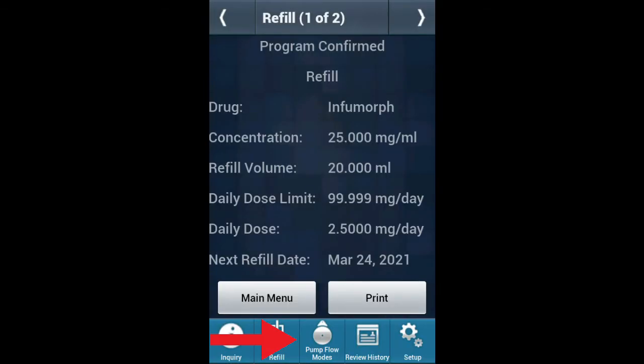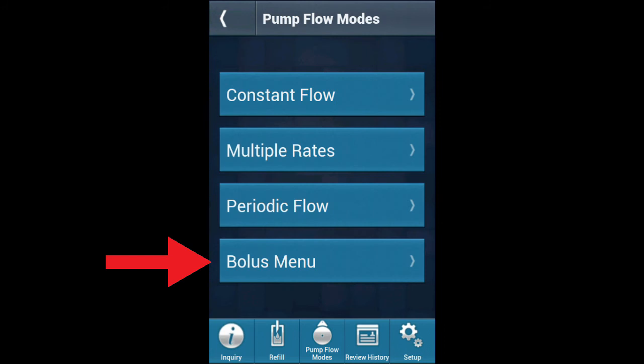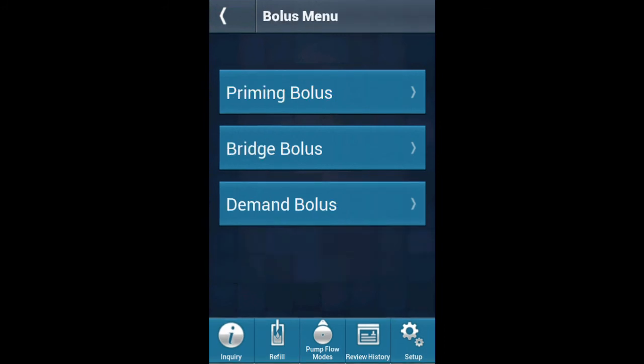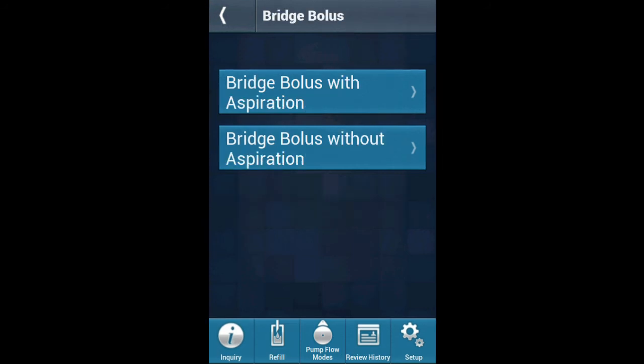Click Pump Flow Modes. Here you will see an option to click Bolus Menu. Click Bolus Menu. Here you will see an option to click Bridge Bolus. Click Bridge Bolus. Here you will see an option for Bridge Bolus Without Aspiration. Click Bridge Bolus Without Aspiration.